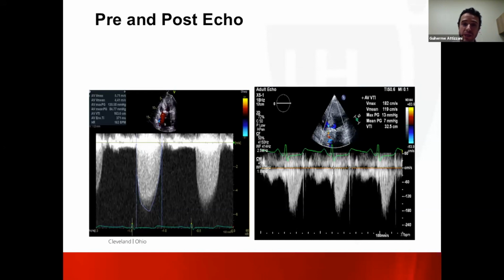I did a case this week, very interestingly. This week I did a case of a patient that had narrow sinus, narrow STJ, and a low takeoff of the coronary. We decided to implant the valve deeper. We were doing good oversizing just to enable future access. Some concern with acute occlusion, but deeper implantation on purpose to enable future access to the coronaries easier.